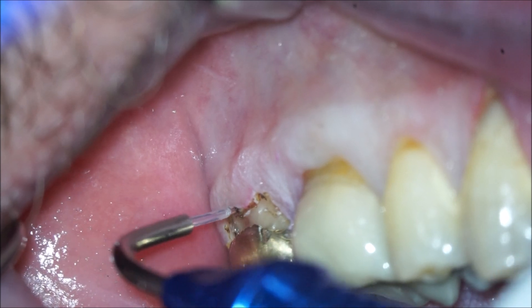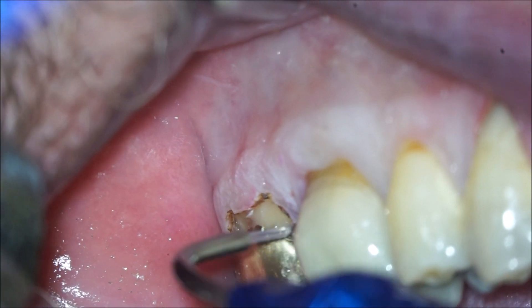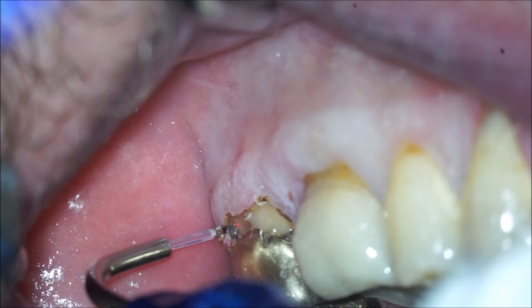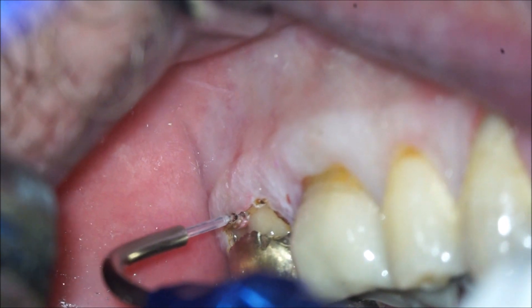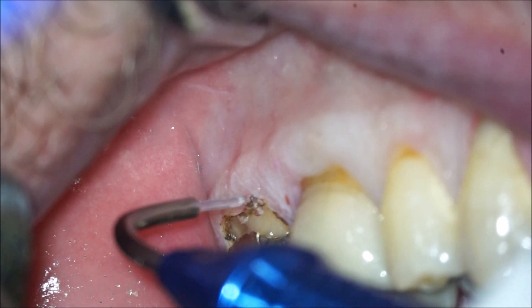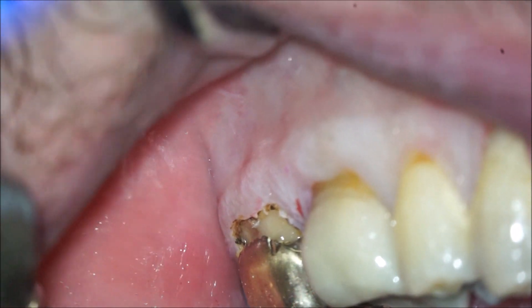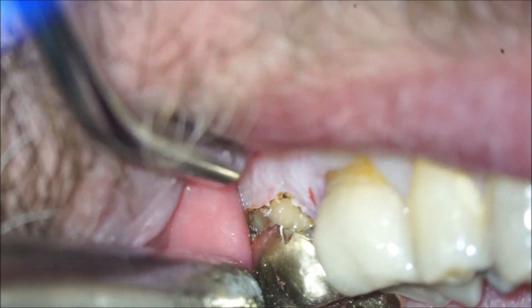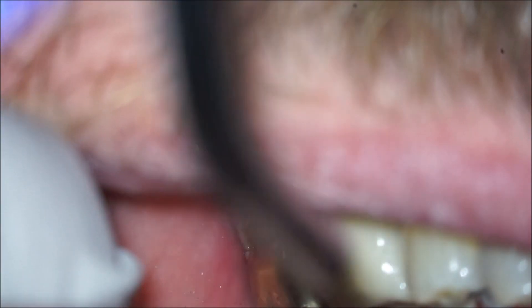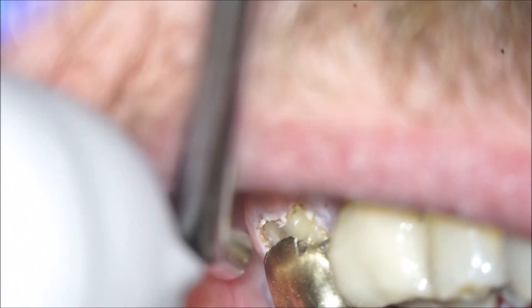The goal is not to vertically lower the tissue to get a 100% clear view — that's really unnecessary in this case. What I am doing is creating a little depth to the sulcus where I'll be able to get in there with an instrument and clean up any excess. I'm also getting a little horizontal displacement between the tooth and the gum so that, first, I can eliminate the bleeding, and second, I can pack things in there cleanly, clean them up, and carve the amalgam back.